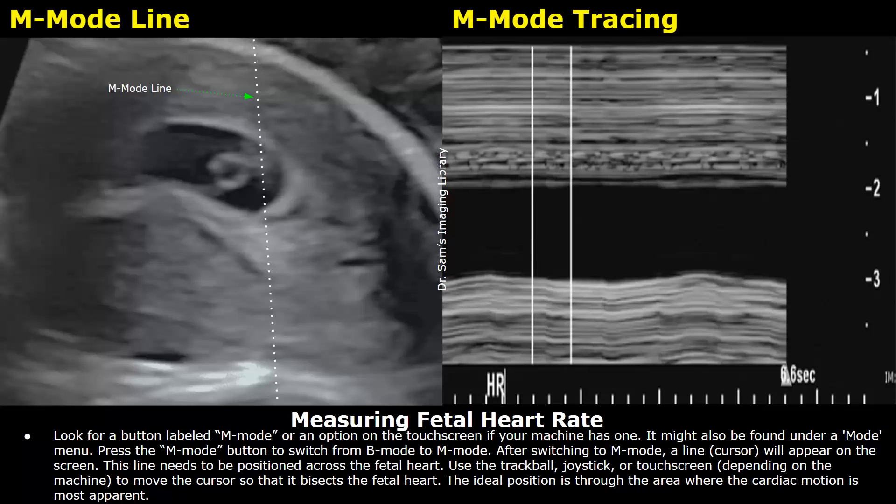Press the M-mode button on the machine or on the touch screen, or it may also be found under a mode menu in some machines. Press this M-mode button to switch from B-mode to M-mode. After the button is pressed, a line will appear on the screen — this is the M-mode line. Use the trackball, joystick, or touch screen depending on the machine, and place this M-mode line over the flickering rhythmic movement inside the embryo. This line must pass through the small rhythmic movement — that is the heart — to give an M-mode tracing.